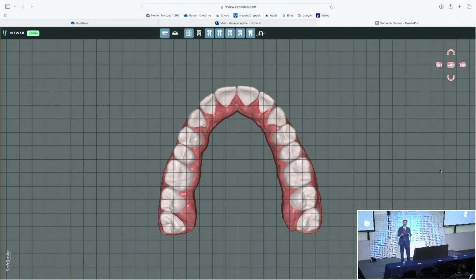They're in line. So what will probably happen when I get through these aligners is I'll make a retainer and monitor the lower wisdom teeth, because when they get all the way in, I need the retainer to cover them. We're going to maintain 32 teeth for her. So she leaves for the semester with these, and she'll wear them all the way through.